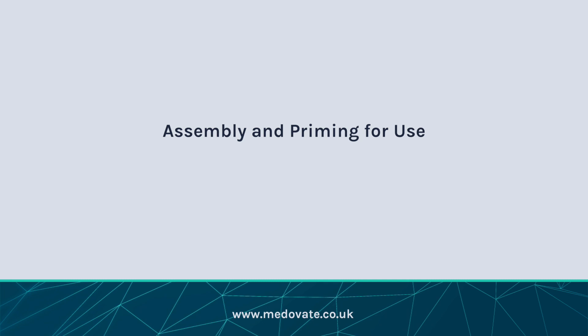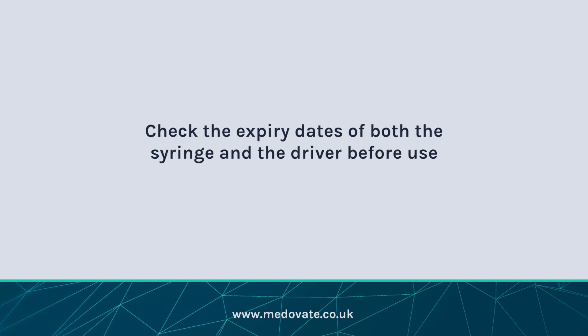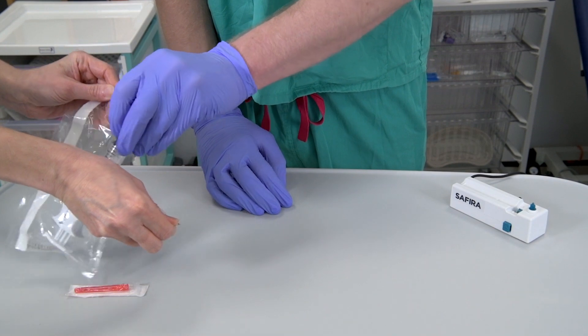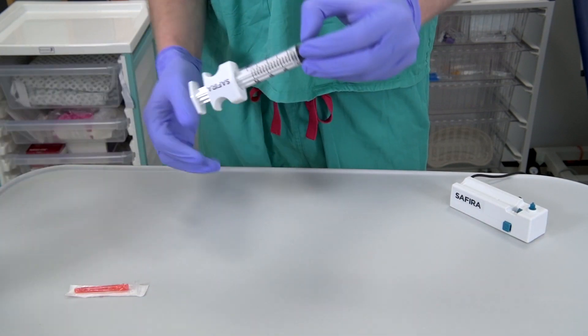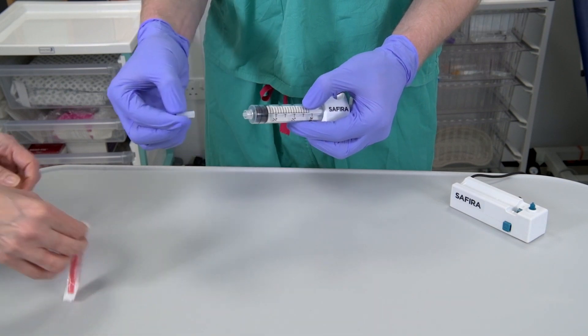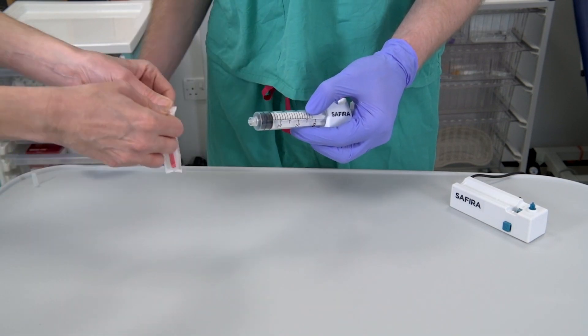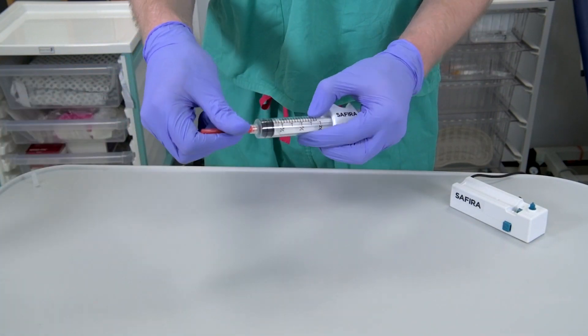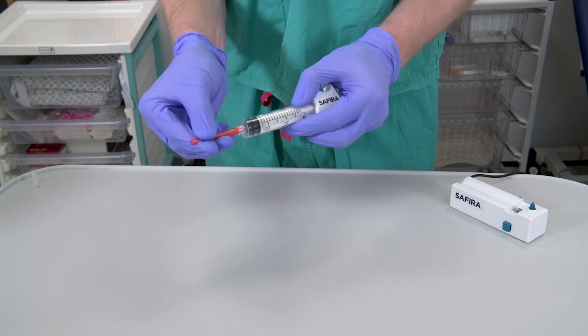Assembly and priming for use. Check the expiry dates of both the syringe and the driver before use. Follow local hospital guidelines for cleaning equipment before use. Using aseptic technique at all times, remove the sterile syringe from the packet. Remove the protective cap from the end of the syringe. Affix a filling needle to the syringe and, using standard approved hospital technique, fill and prepare the syringe.